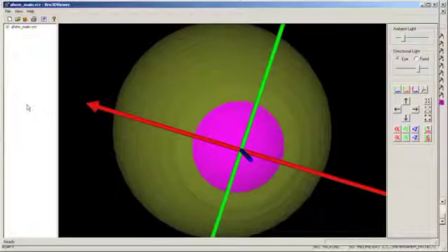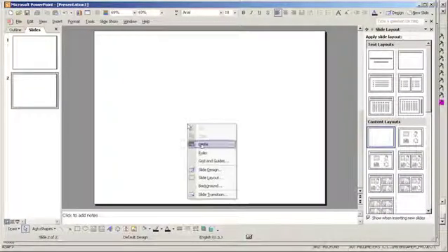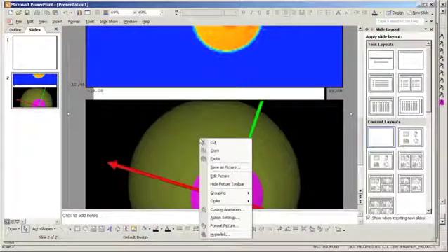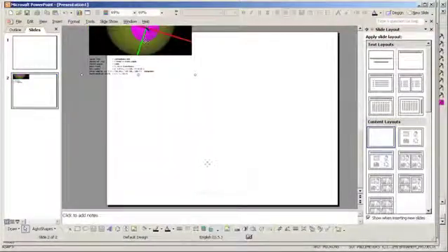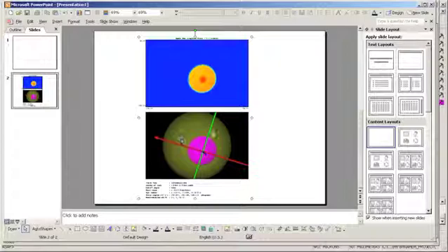And behind the scenes, that's been put on the clipboard. So I can take that information and go over to PowerPoint and paste that in. And there it is. So let me make this a little bit smaller. So I paste that into my PowerPoint. So I have a representation of the orientation of the eyeball here. And then I see a graphic of the lit appearance.